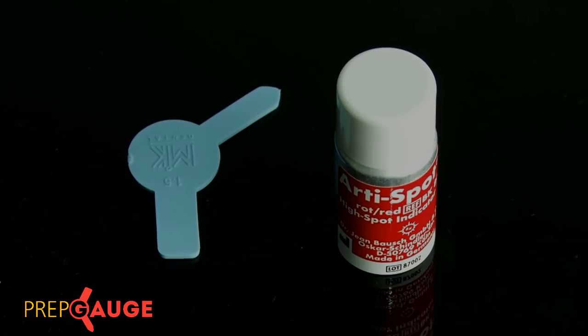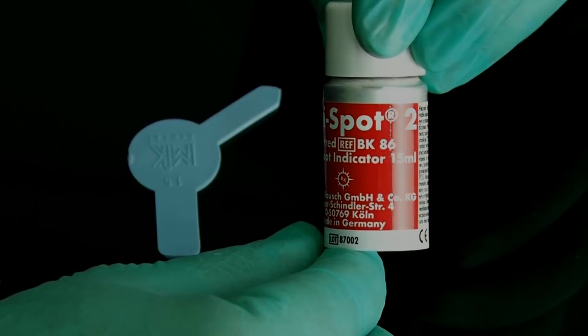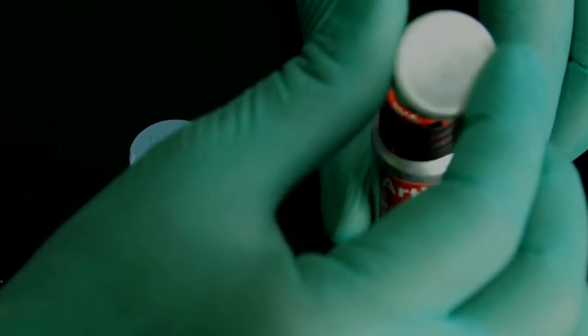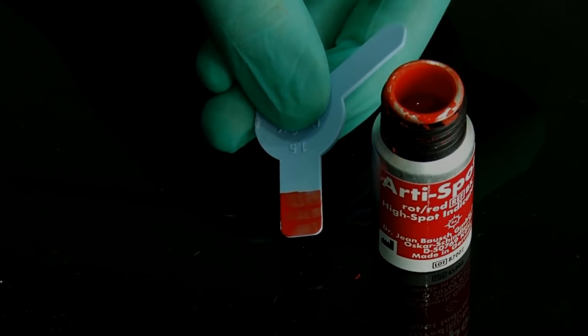Although Prep Gauges work beautifully in telling us whether clearance is adequate or not, what they unfortunately cannot tell us is where exactly the reduction is less. In such a situation, we can use indicator sprays or paints available in the market. What I prefer to use is a product from the company Bausch called Arti-Spot 2 — an indicator paint. All you need to do is apply it onto the gauge like nail paint, and once dry, it leaves a 3 micron film.